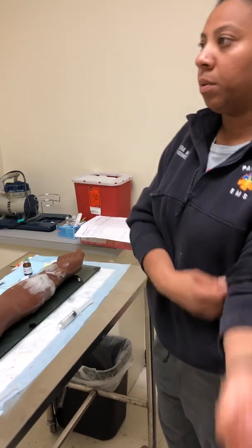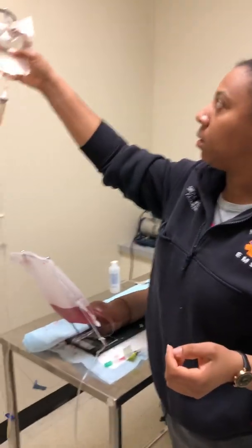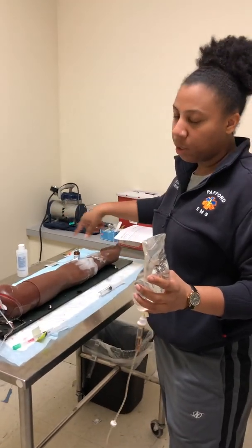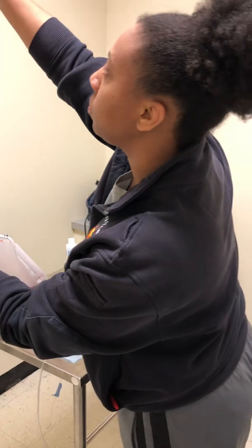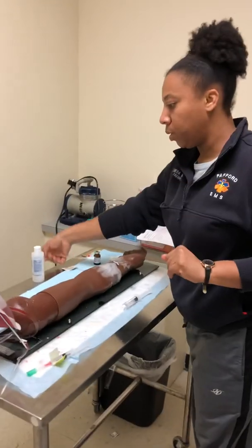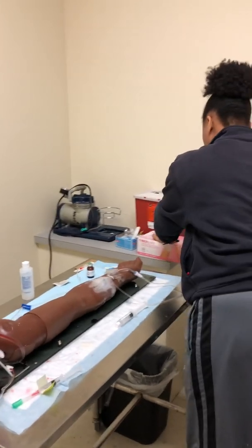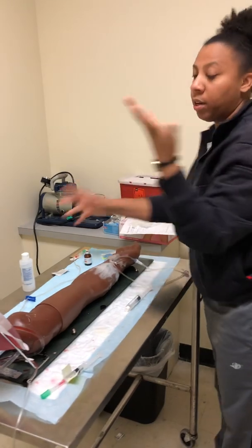All right. I would check for patency of the IV site, which I would lower this down. I should have some kind of blood return in that. That'll let me know that it's actually still patent. Okay. After that, I'm going to get myself situated. I'm going to go ahead and put gloves on, after I clean my hands again.